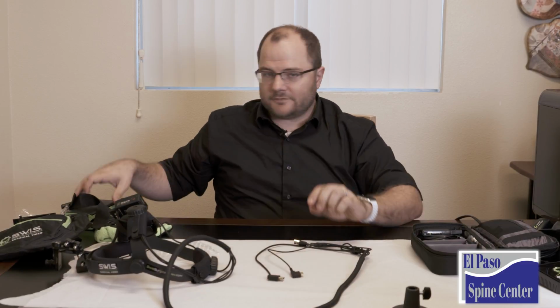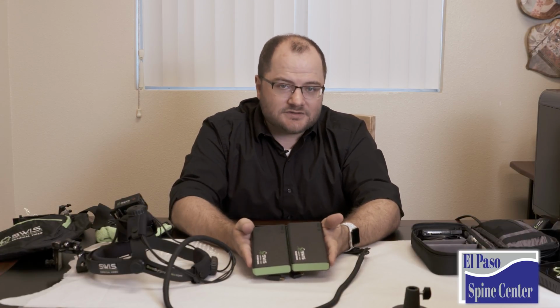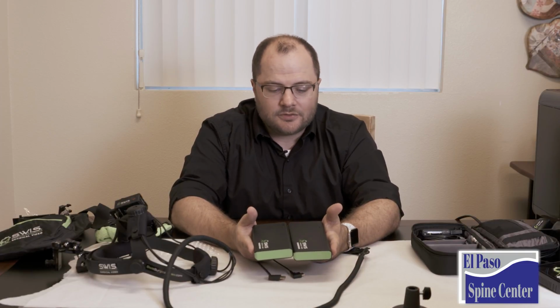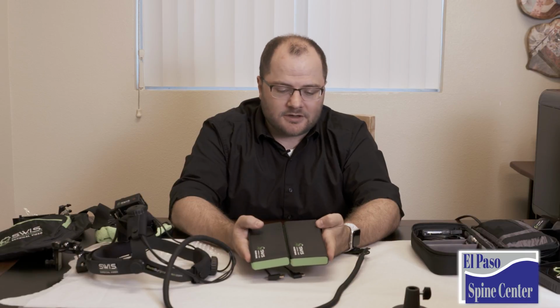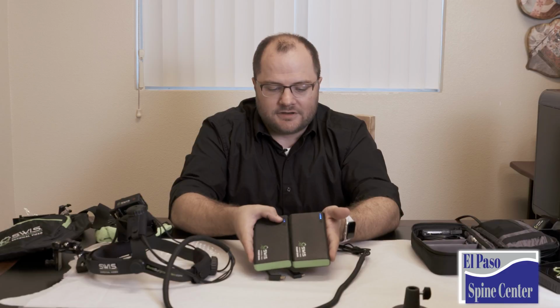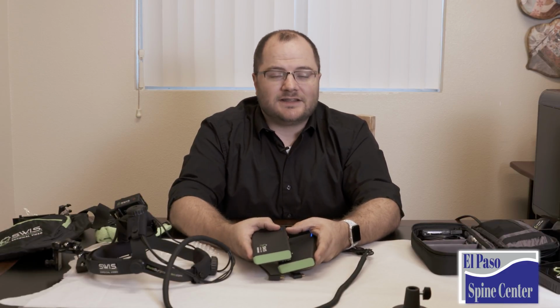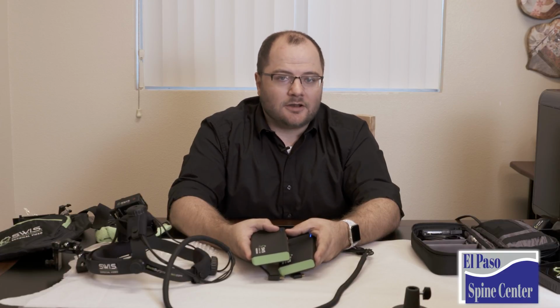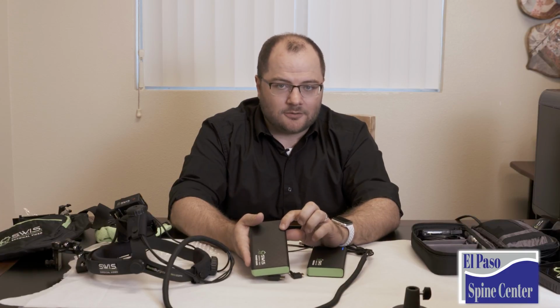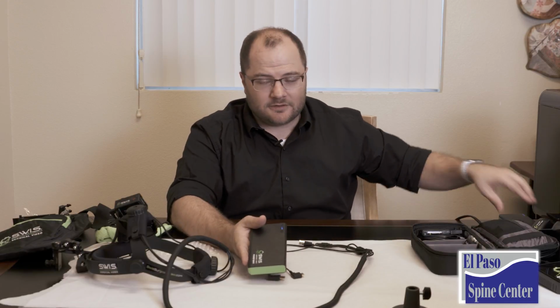So the first thing we're going to need is power. You're given 2 battery banks. That's really nice because if one runs out, you can immediately swap it out. To turn them on, you actually have to press that blue button, which should show blue indicators. Something I discovered when doing this: if the blue indicators are not on, it's not feeding power to anything. In other words, you can have everything plugged in and not get any power until you actually hit that blue power button. That's kind of nice because it's not wasting power if it's unplugged and there's nothing there.